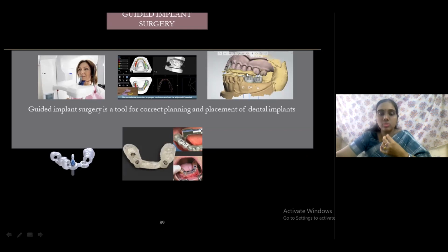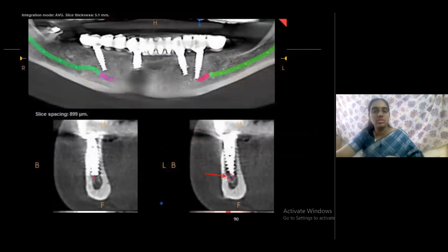The patient will be exposed to CBCT while wearing the denture, and then the exact radio opaque markers will be seen in that radiograph, and we can make measurements around the bone which is present around the radiographic markers. So those are radiographic markers, and these are surgical stents which will be helpful for implant guided surgeries. So I want to show you some of the cases.